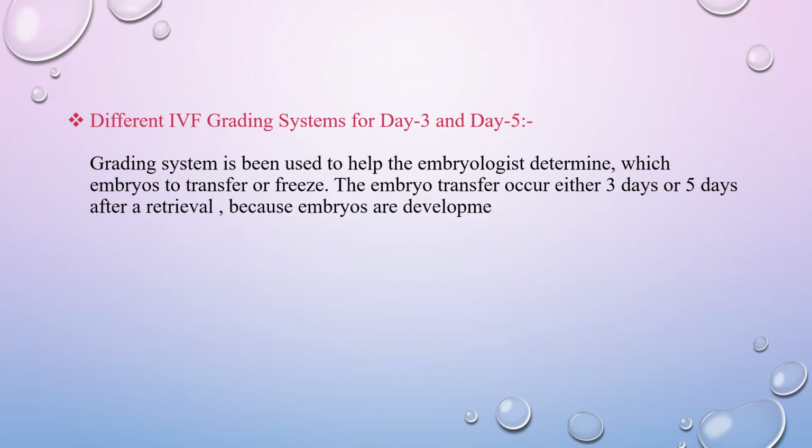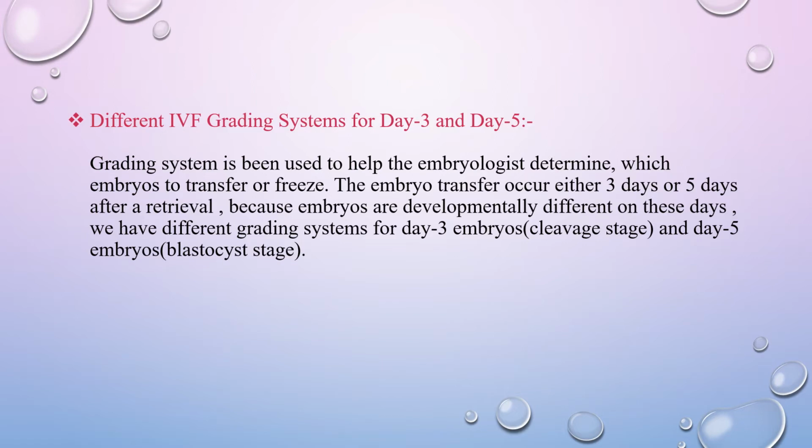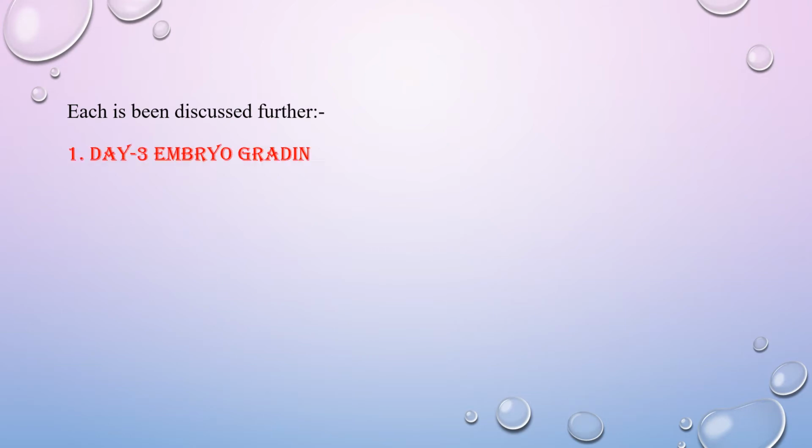Because embryos are developmentally different on these days, we have different grading systems for day 3 embryos, that is the cleavage stage, and day 5 embryos, that is the blastocyst stage. Each will be discussed further. First, day 3 embryo grading: quality of division.